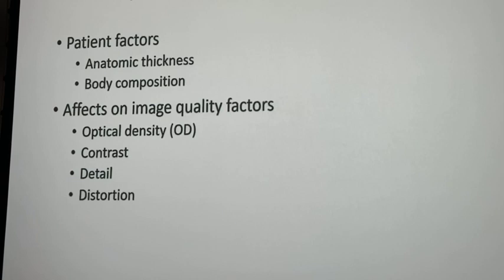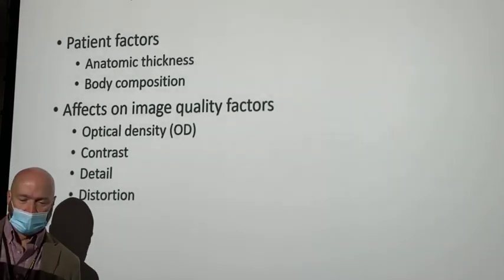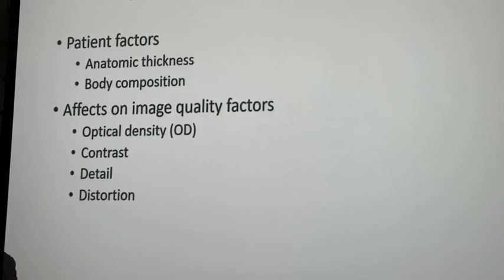The lookup table, if you've watched the videos, I kind of briefly described it, but whenever you get a new set of equipment or a new room, maybe they converted the entire hospital to a different vendor, radiologists will sit down with usually one or two radiologists with applications tech and maybe an x-ray tech, and you'll look at representative examples of every exam type. So fingers, hand, wrist, forearm, and so forth.